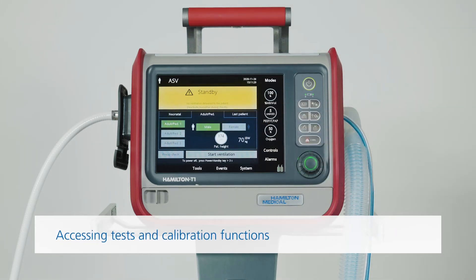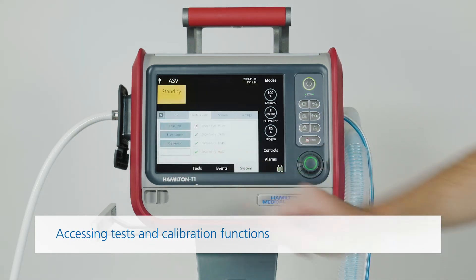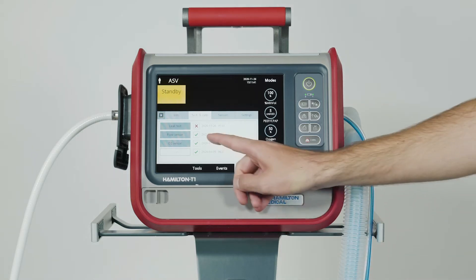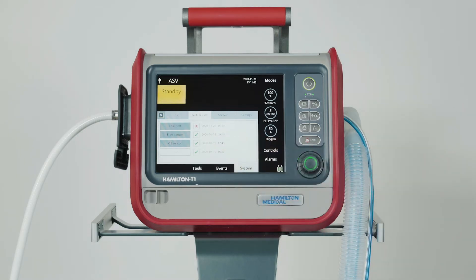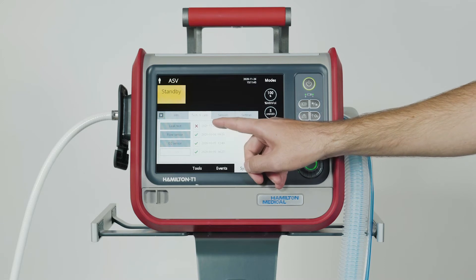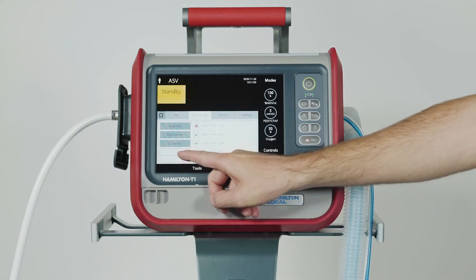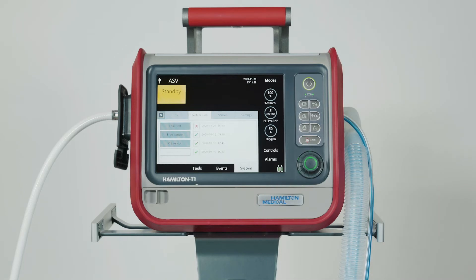To access the test and calibration functions, touch Pre-op Check in the standby window. The Tests and Calib window opens. A green check mark tells you the component is calibrated and ready, while a red X shows that the last calibration was not successful. If you see an empty box, this means that the test or calibration has not been carried out. If CO2 monitoring is not enabled, the box will be greyed out.